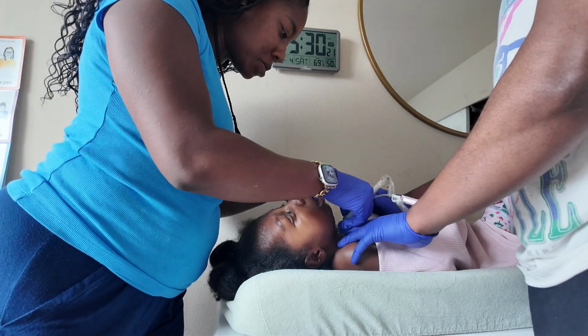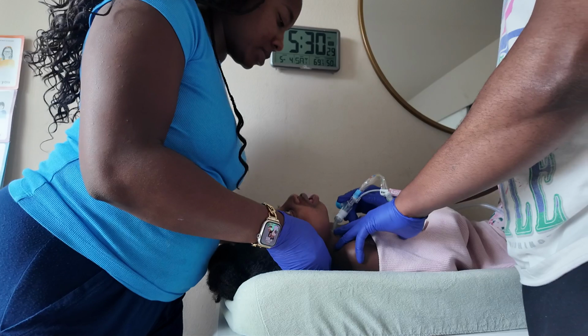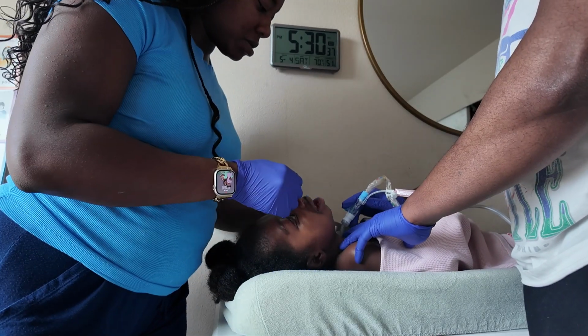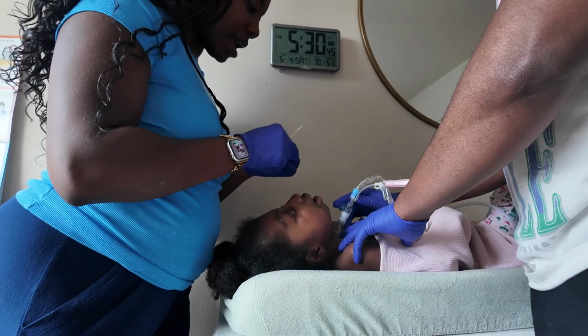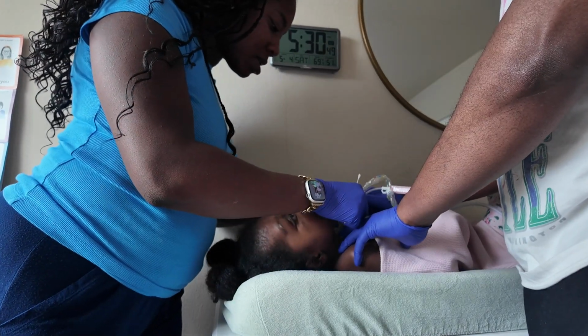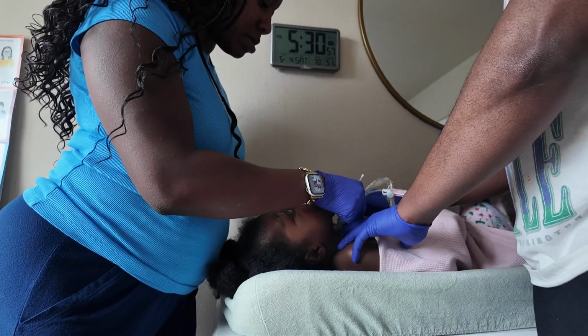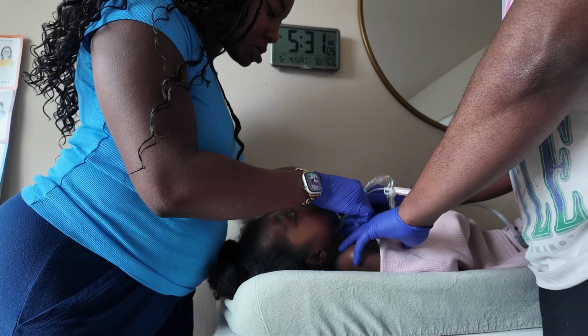So again, wet, then dry, and then I do powder at the end. Some people like to do wet for everything, dry for everything. So it just depends on your flow and how you like it. Again, now I am drying and taking the dry Q-tip to get around that stoma. And again, the stoma is the opening and she needs this for her obstructed airway.